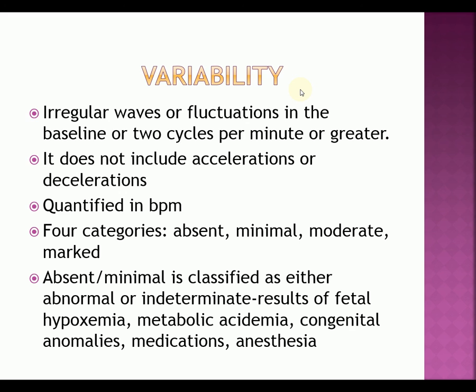So if we have minimum variability and tachycardia, that's a really bad thing for us to be having our babies in severe hypoxia. So we need to be sure that we're looking at that.